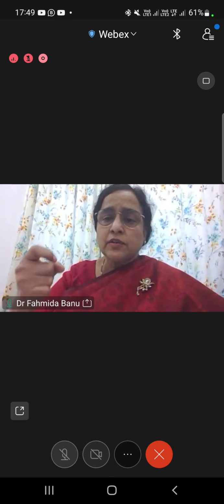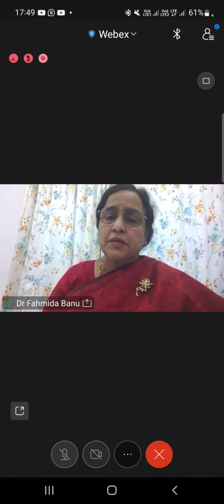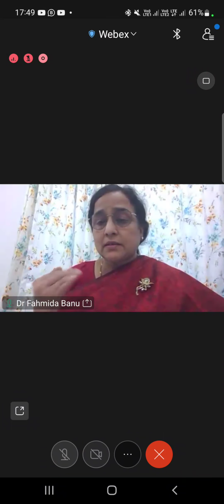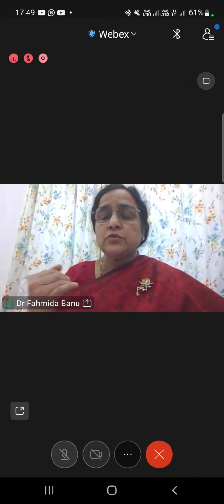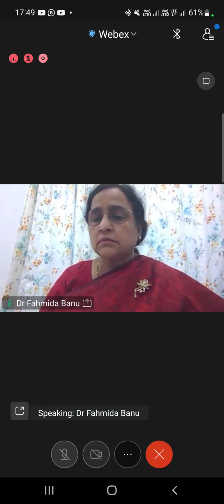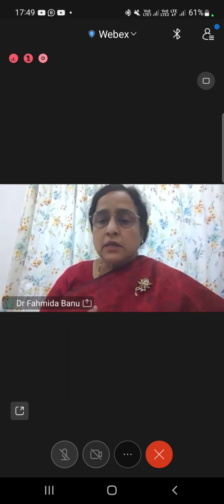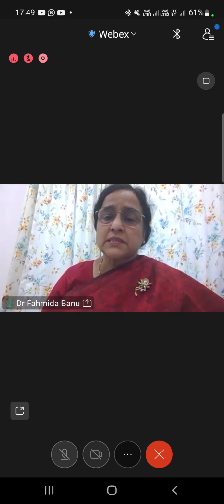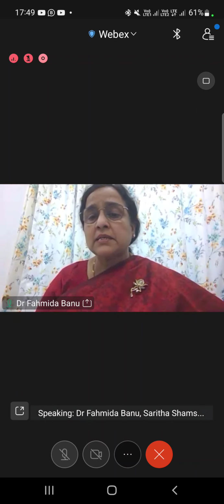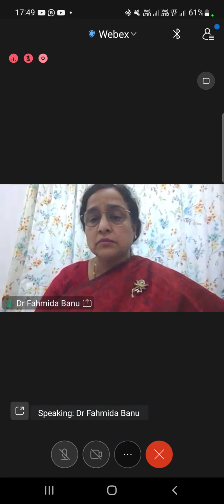Without realizing, you will be just cutting through the myometrium. So you have to first do a lot of diagnostic procedures, then you should start doing resection of the endometrium. Compared to the other thermal ablation techniques, the complication of transcervical resection of endometrium causing adjacent organ damage is relatively more.